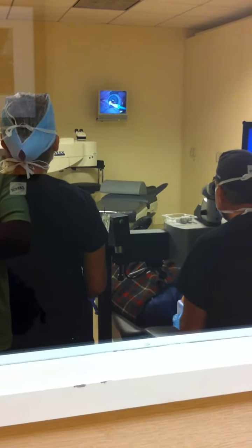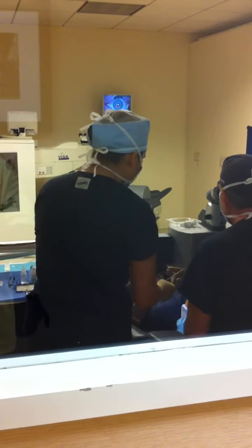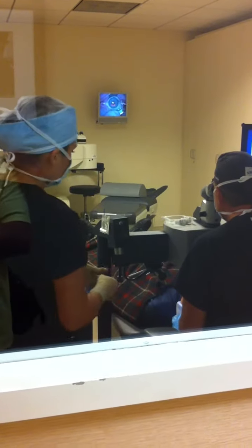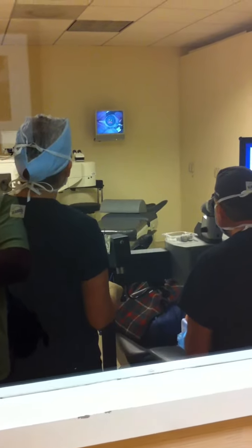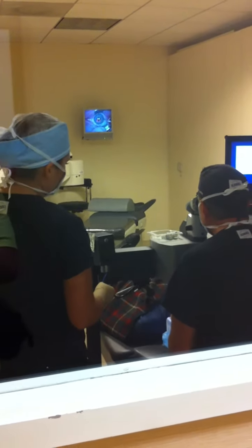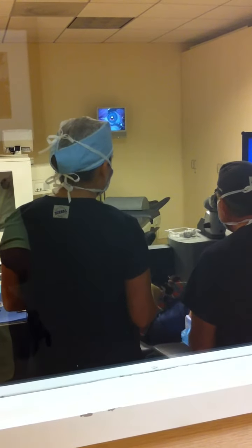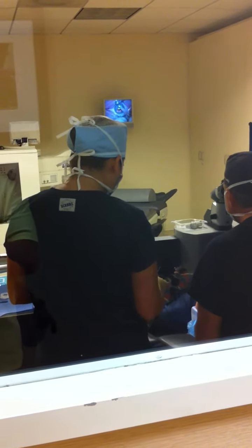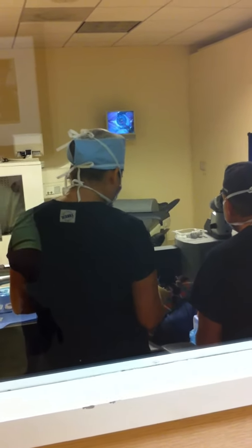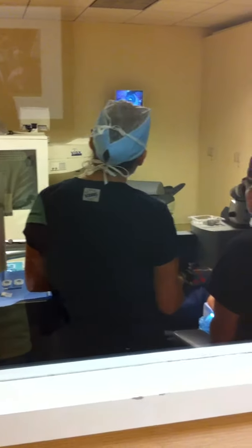So we're brushing the top layers off, 50 microns of tissue, leaving the rest of the cornea ready. This other tool does the job a little bit better than a sponge. Ooh, that's a little bit sharper. The cornea is only a half millimeter thick, but very strong. Gonna just clean around the edges. Ooh, looks like they chunked a piece off there. Oh, shoot. They're gonna have to put that back on later. Luckily, what he scraped off regrows rapidly.